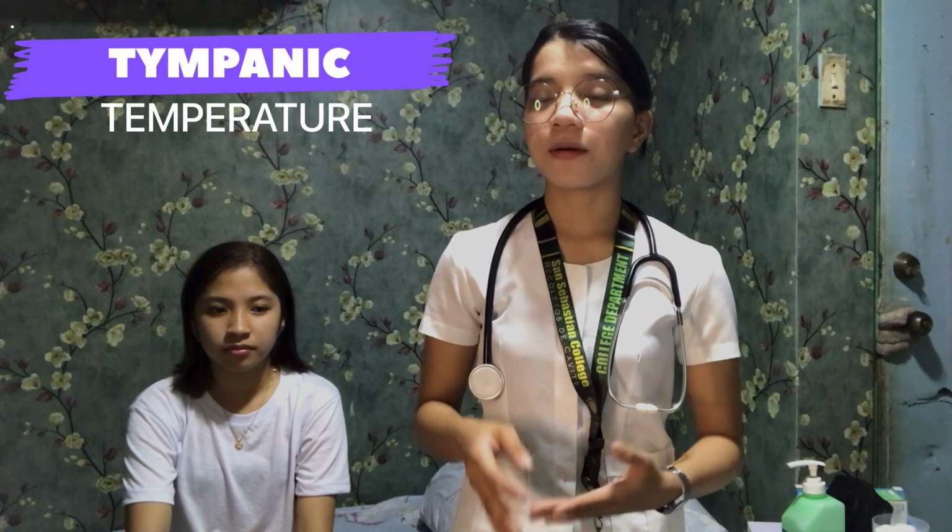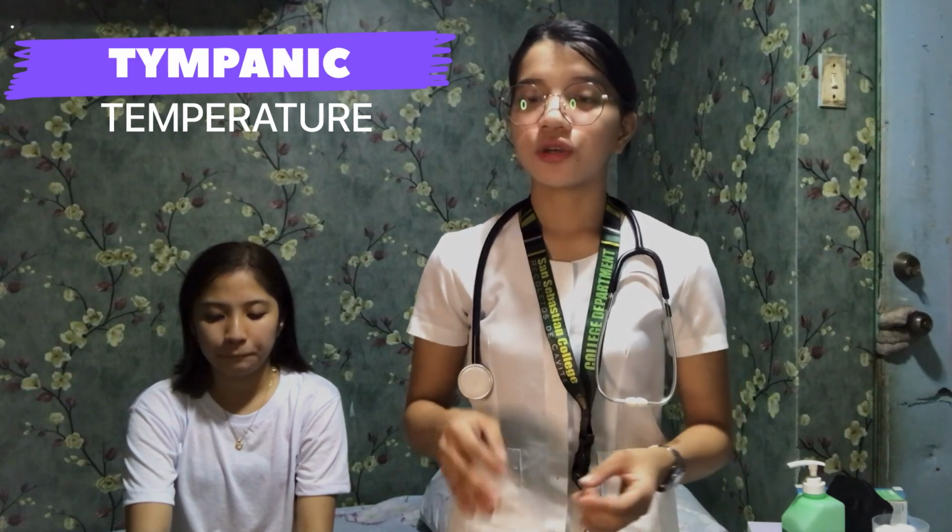After assessing the body temperature or the axillary temperature of the patient, the next thing we do is proceed to the tympanic temperature. Before we proceed to the tympanic temperature, we need to perform hand hygiene first.